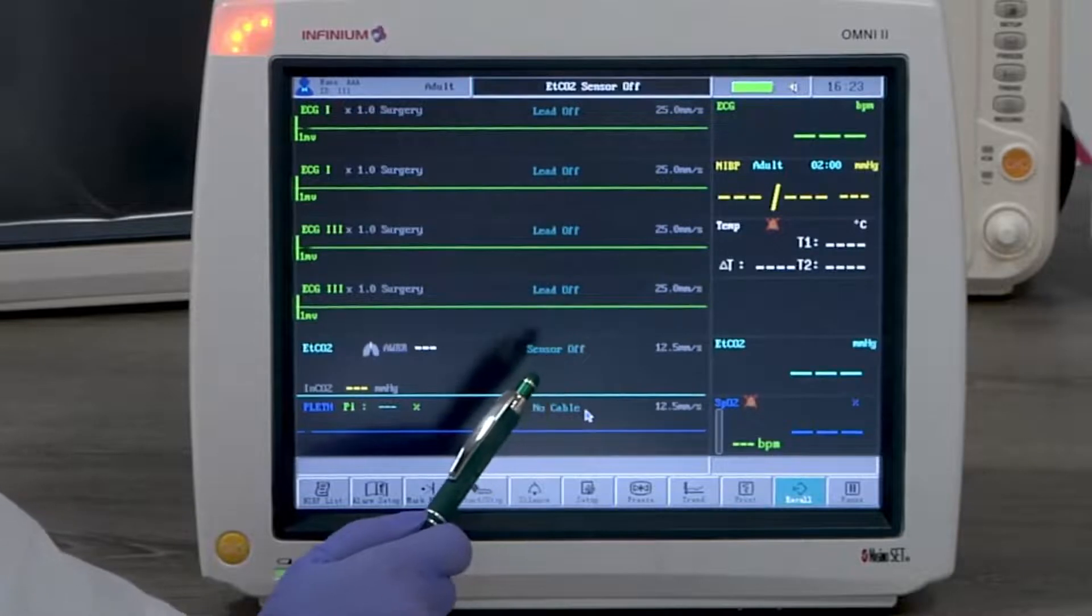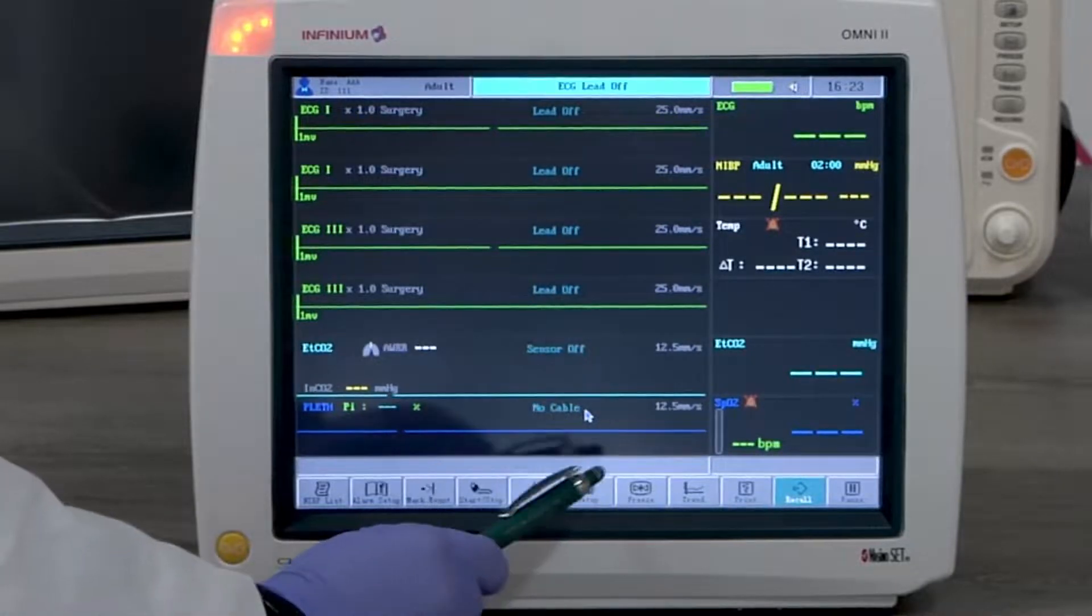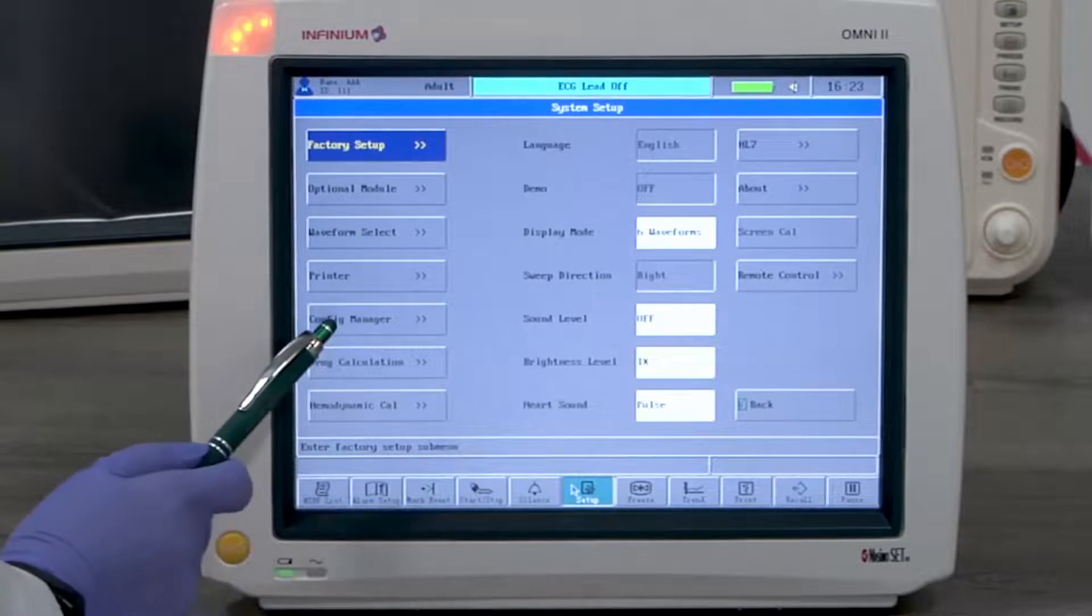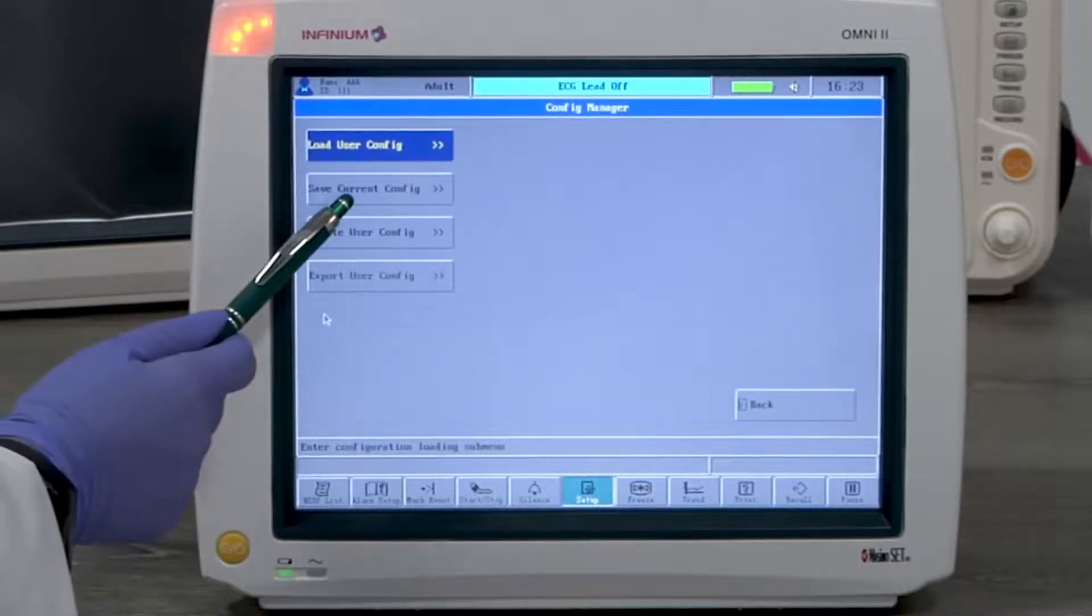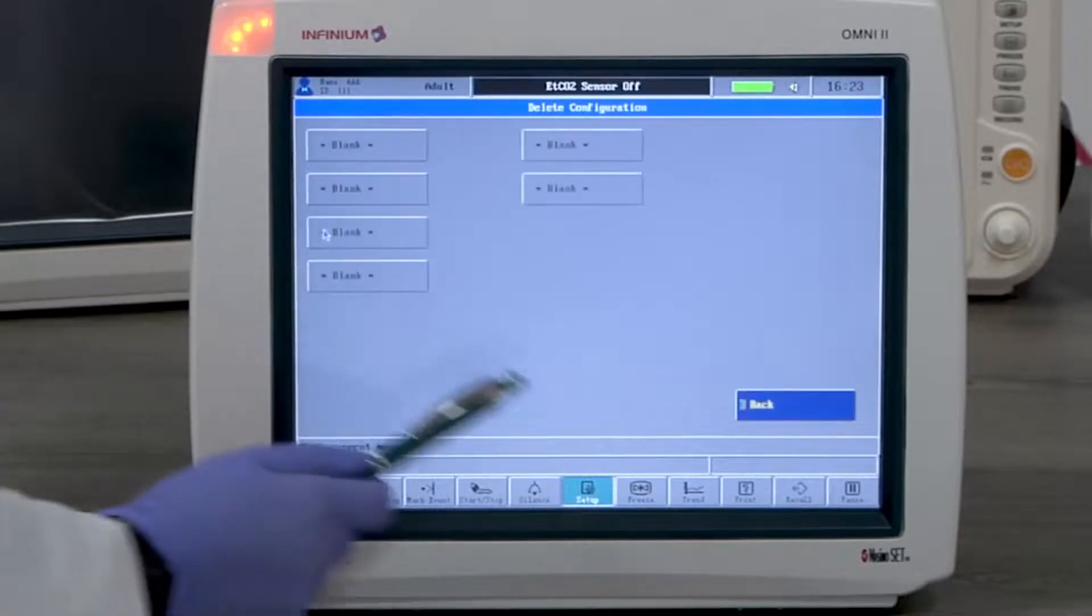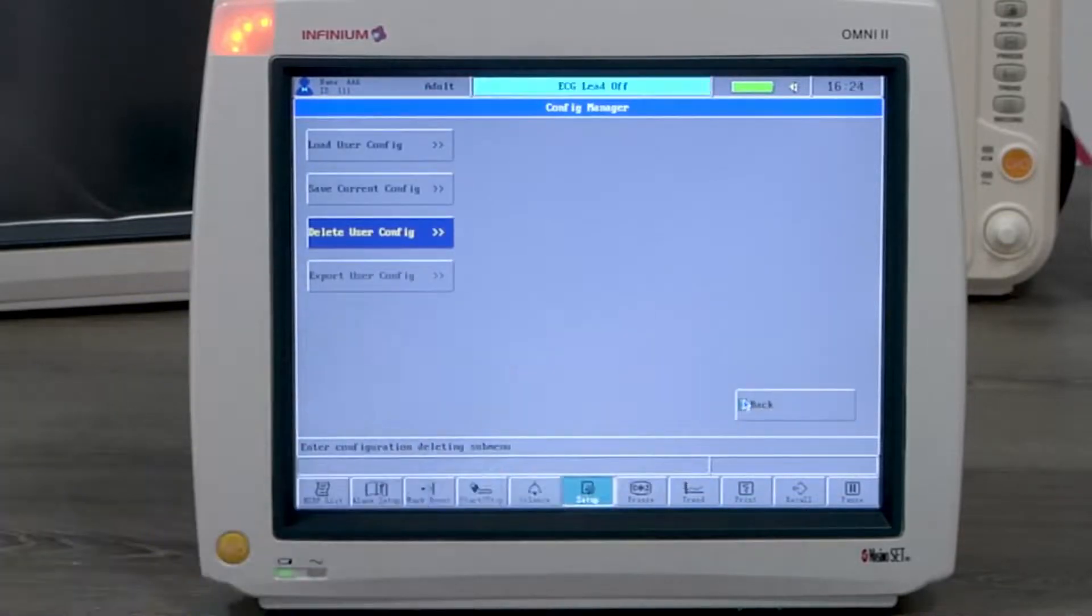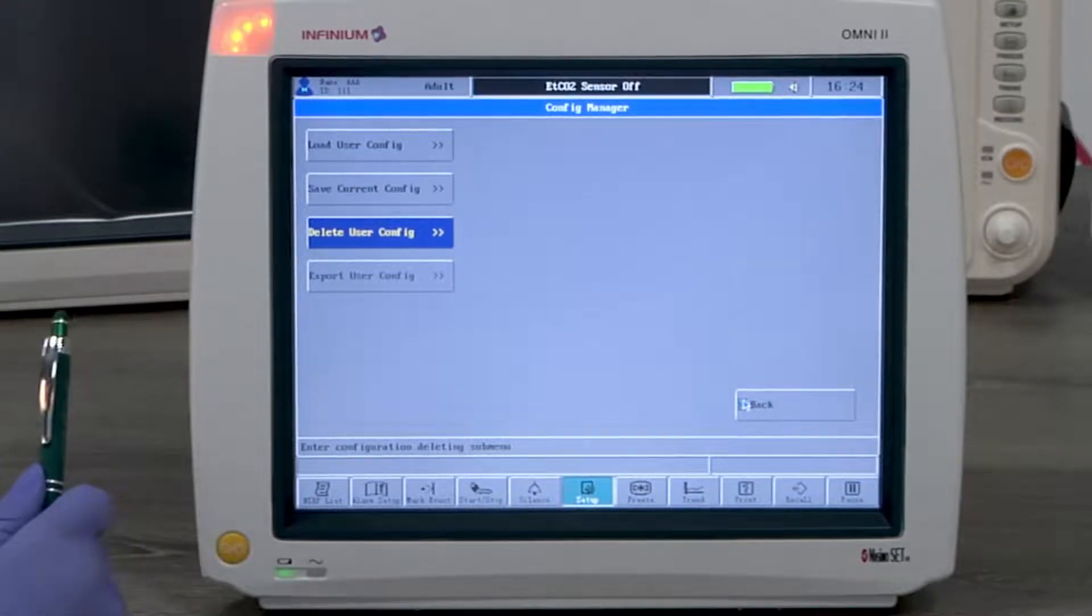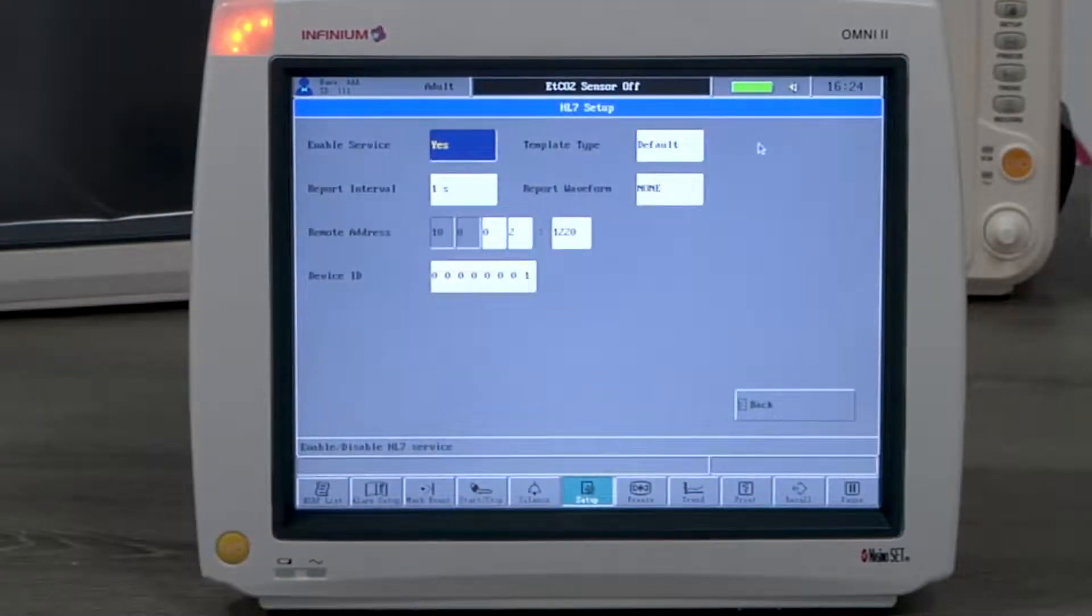Some other settings under system setup menu include config manager, which gives you the option to save the current configuration or load or delete a saved configuration. This is convenient when there are multiple users using the same monitor. They can set configurations to their own preference. HL7 feature is for connecting the monitor to a compatible EMR system. This is a password locked option available upon purchase.